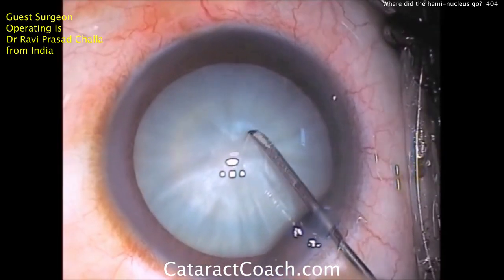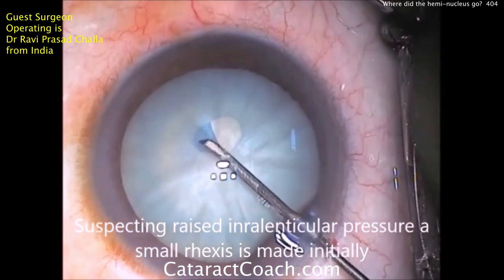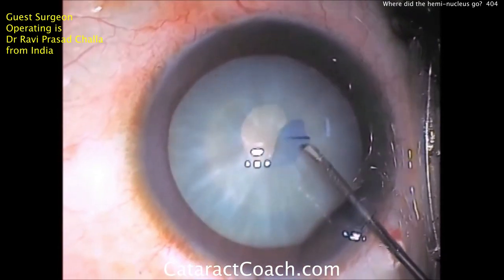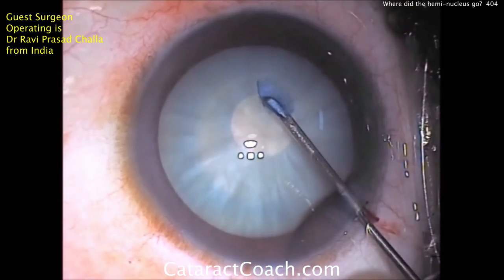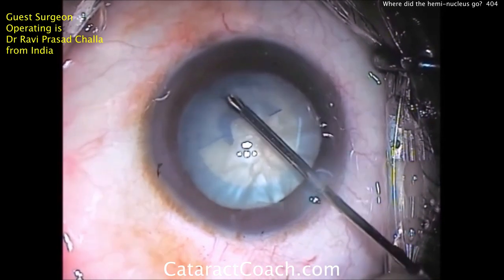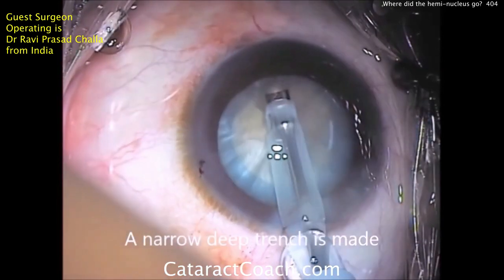Very interesting case here. This is a white mature cataract and he's going to use the double rexis technique. He's going to make a small central capsulotomy, done with just a paracentesis incision so that the anterior chamber is highly pressurized. Then the second rexis can be done afterwards, and that looks beautiful — a beautiful rexis here.